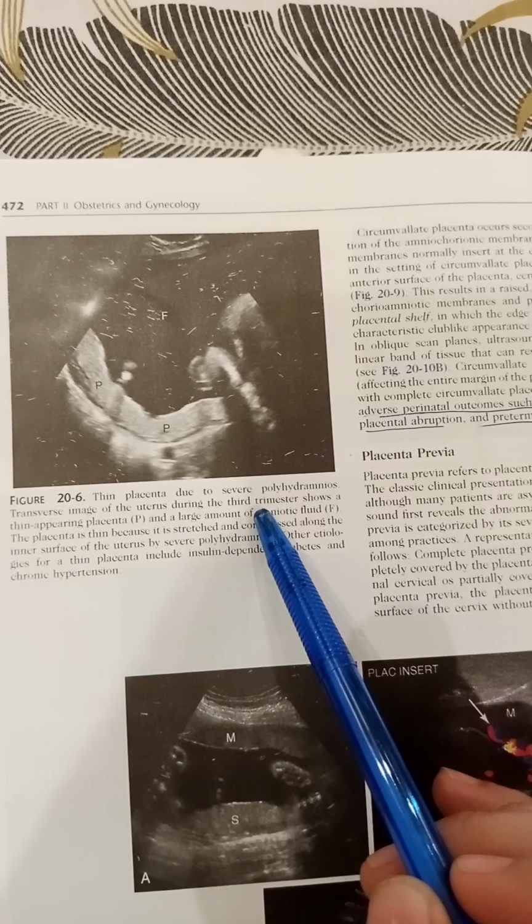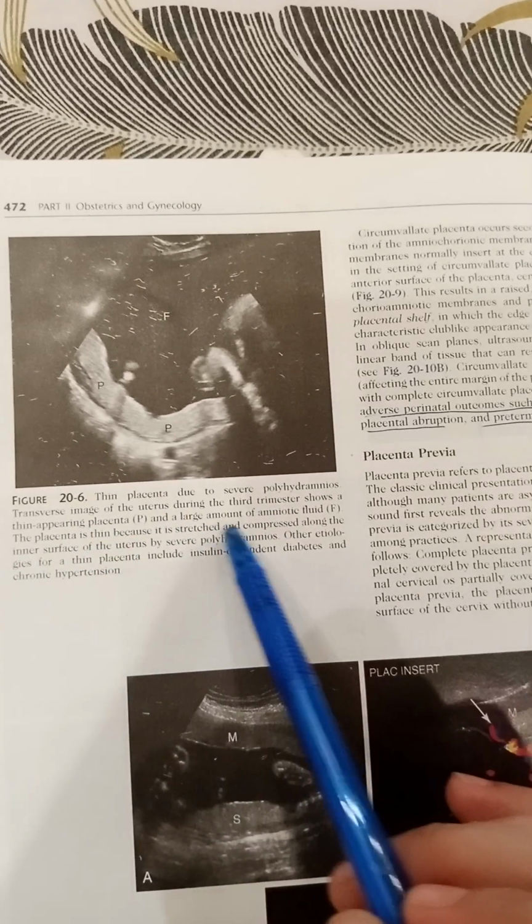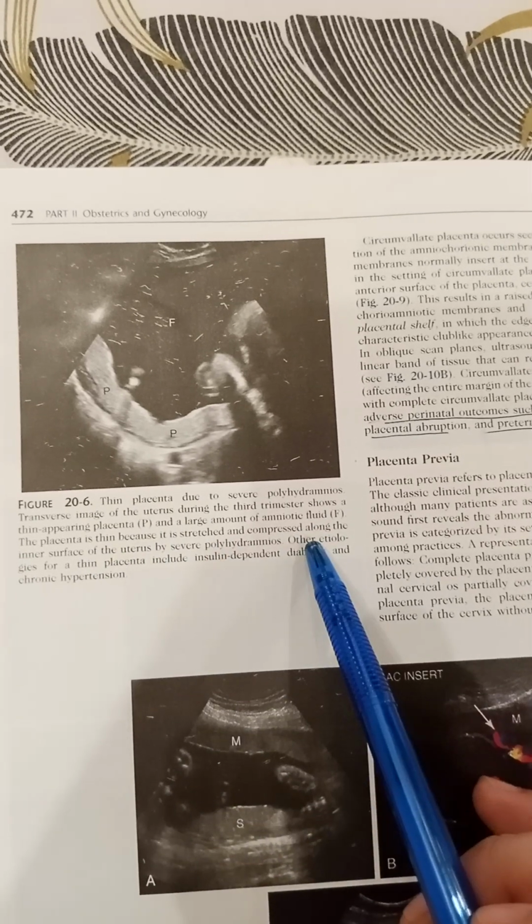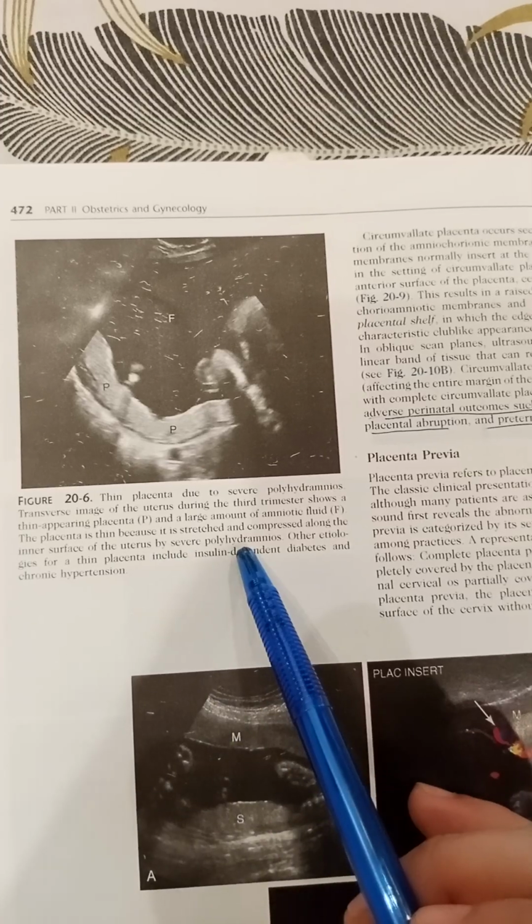Transverse image of the uterus during the third trimester shows a thin appearing placenta and large amount of amniotic fluid. The placenta is thin because it is stretched and compressed along the inner surface of the uterus by severe polyhydramnios.